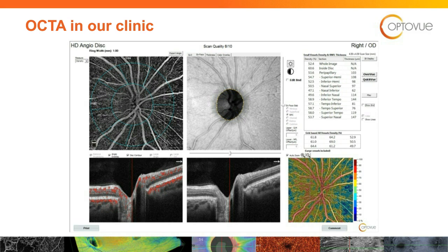This is now with analytics. And when you take a look at this, again, this is right over the disc. This is an OCT angiogram of the optic disc. We've got a nice image here. We've got the OCT angiogram on the left with the B-scan below, and the en-face image on the right with the B-scan below. And notice on the right side here, you've now got a table. It's showing you the vessel density in all of these different areas over the whole image. In this case, inside the disc, parapapillary, etc.